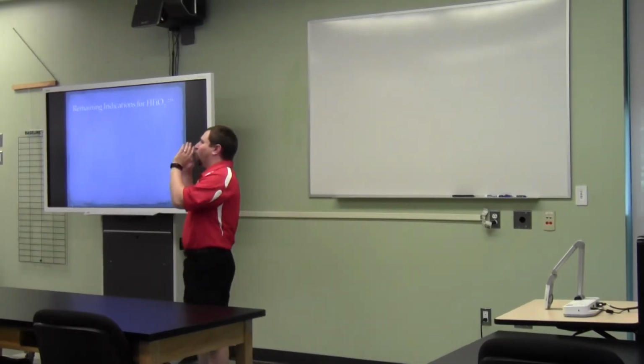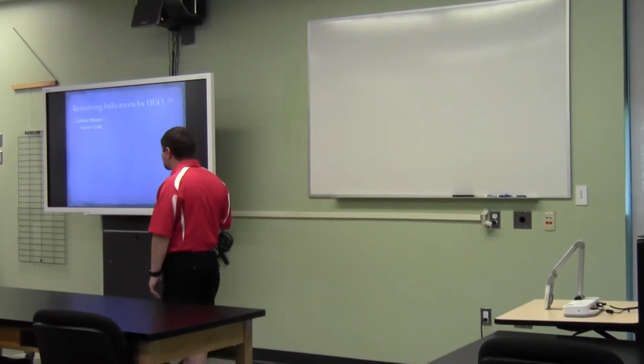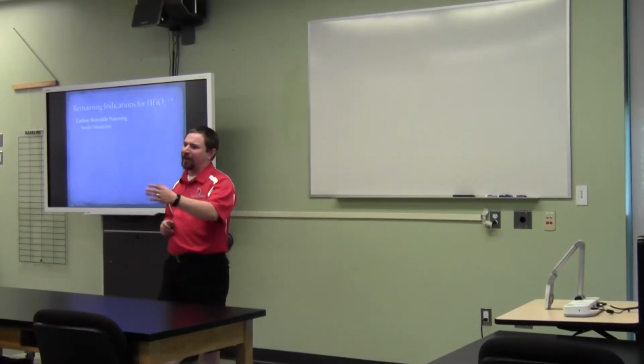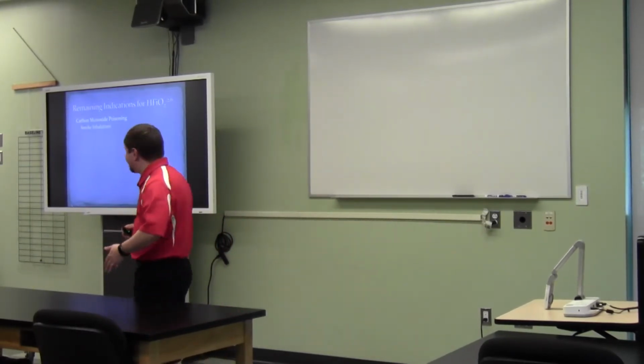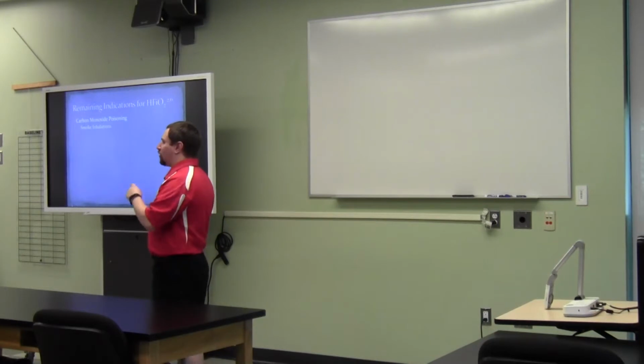Okay, so what do we have left of going, okay, Brian, we can't use high flow as much as we could anymore. When can we use it? Carbon monoxide poisoning. We are going to suspect these things in like smoke inhalation. It's not something we're going to have to see a whole lot as athletic trainers, hopefully. But definitely time we have to do that. Okay, and we'll talk about why a little bit later.